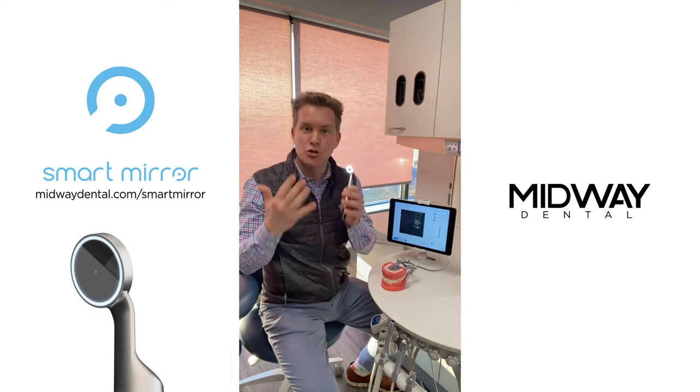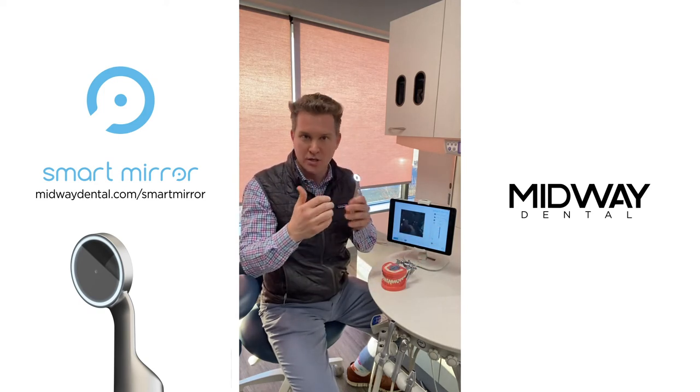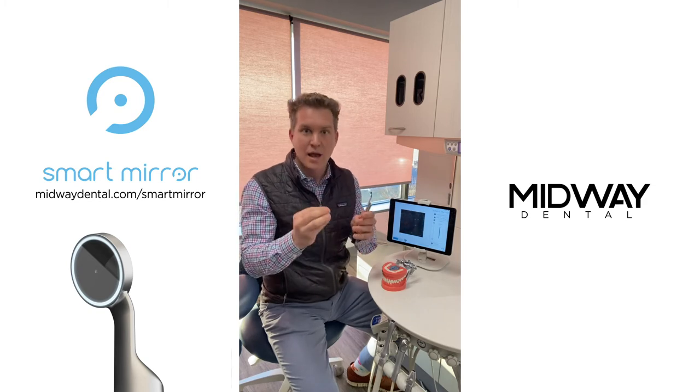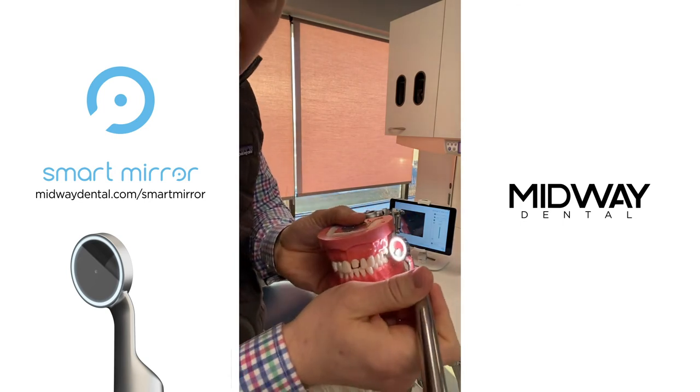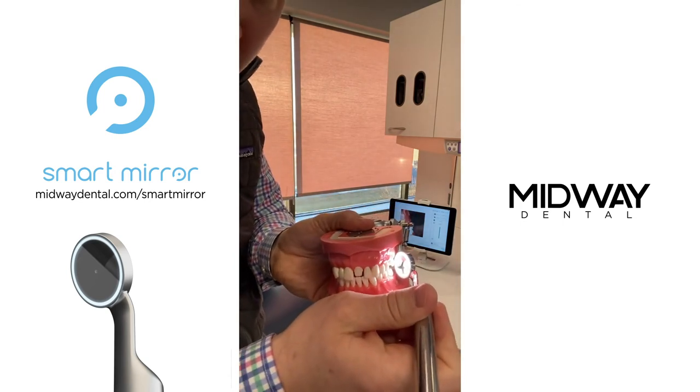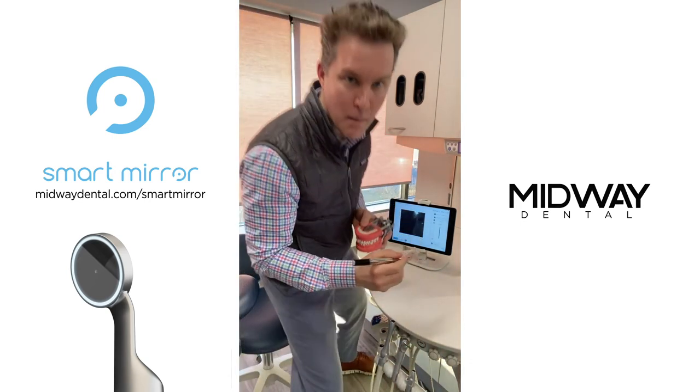These are true color LED lights — some of the most phenomenal, advanced LED lights in the world. From a dental mirror perspective, you're never going to see this much light and illumination in the oral cavity, period.